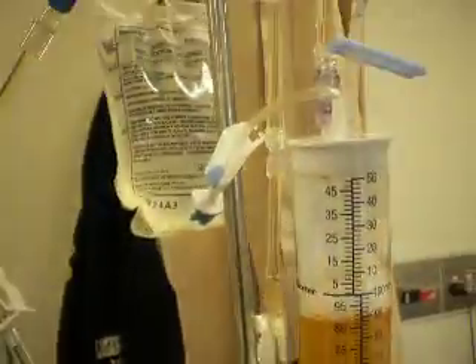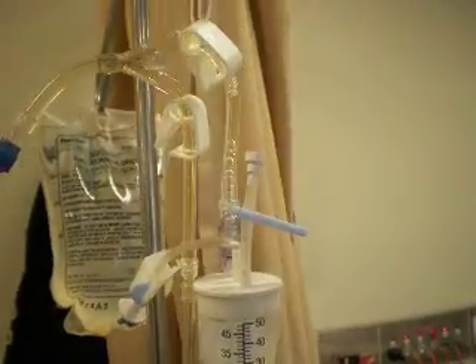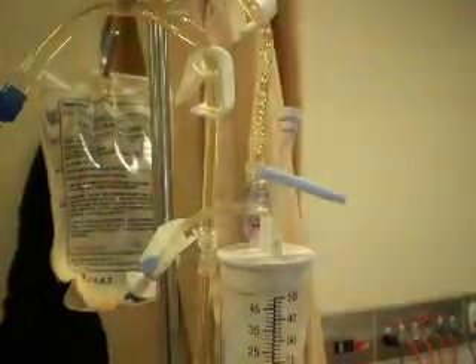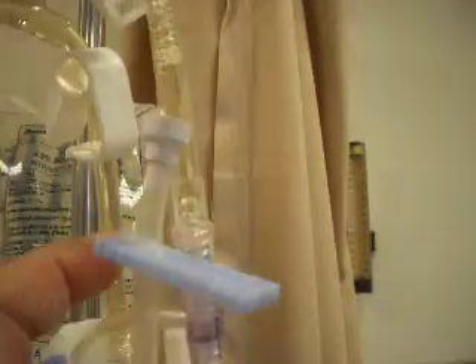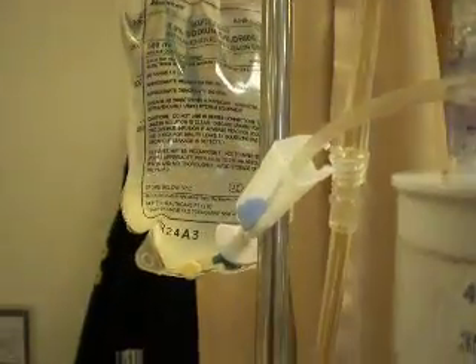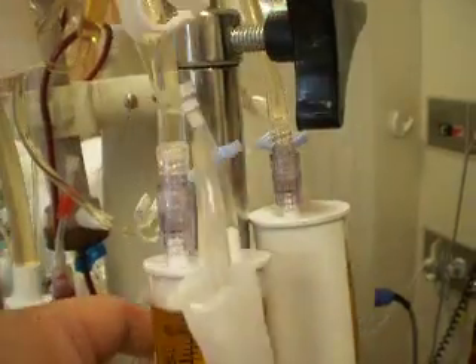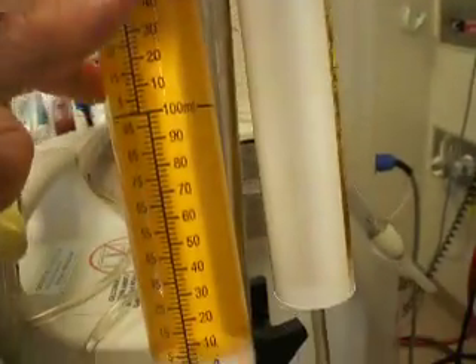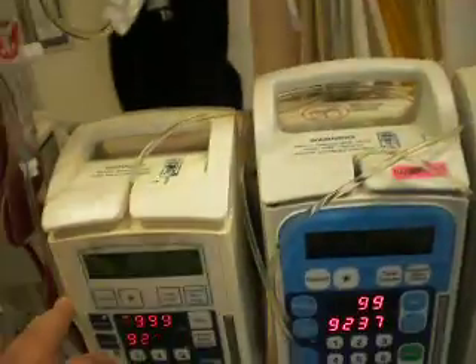Because we need three micro-drip sets and this Y connector, there are only two lines, so we need two similar Y connectors where one side goes into the micro-drip set, the other side goes into another Y connector where the other end can be connected to two micro-drip sets.